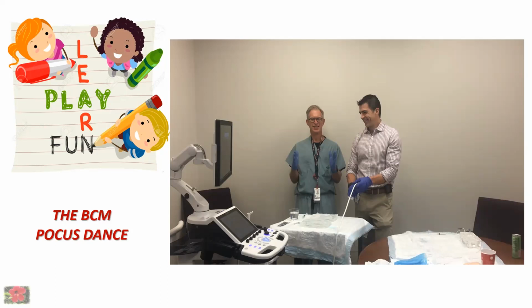Could you actually get the agar or the Jello firm enough for the mold? The Jello definitely broke apart much more quickly and was very friable with one or two pokes. The agar seems to be more durable. And this paper that I found talked about different consistencies and used 2% versus 5% versus 10%. I followed the 5% recipe because that's what they found to be the best balance of density versus the ability to poke it multiple times. Nice. Thank you guys for sharing.